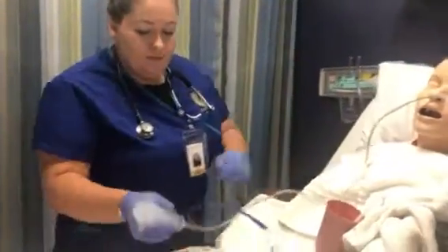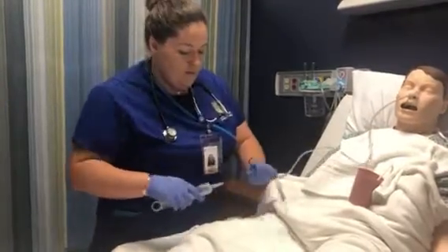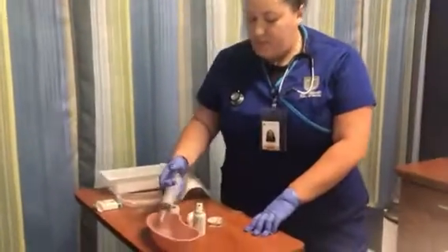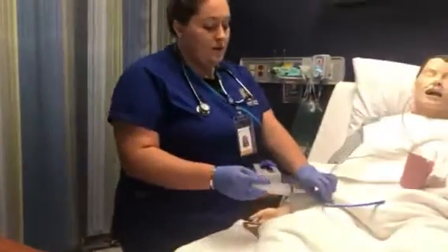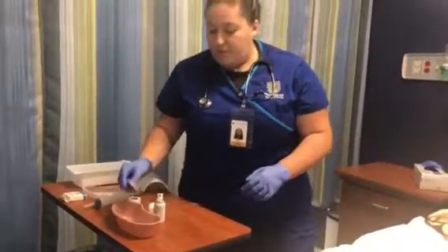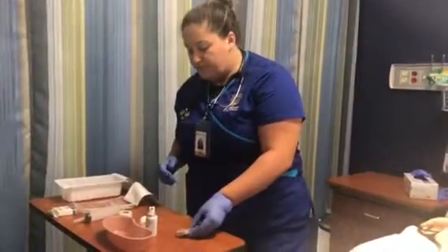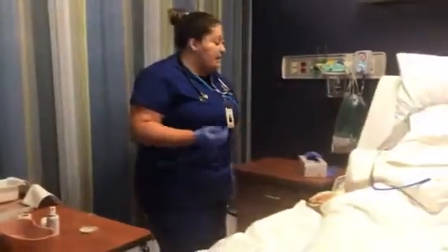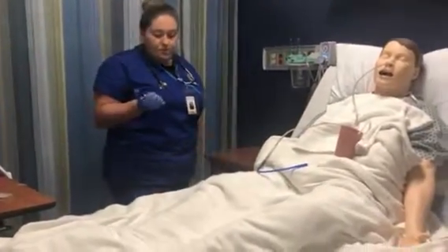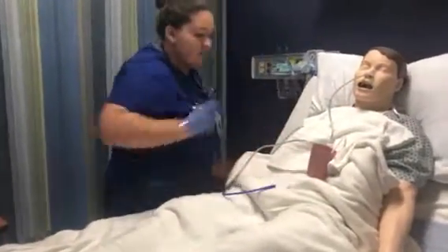Then I'm going to remove the content, about 10 milliliters, from the syringe. Okay, I'm going to place it in here. If I took too much, I'm gonna put back the gastric content. Next, I would take a litmus paper to check for acidity. It should be around 4 or 5, would probably be an orange color. If this was done for feeding, I would send the patient for an x-ray to make sure tube placement was proper. I'm also going to check. Tube seems to be not coiled, properly placed.